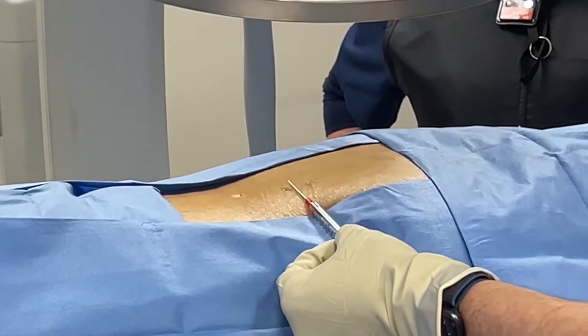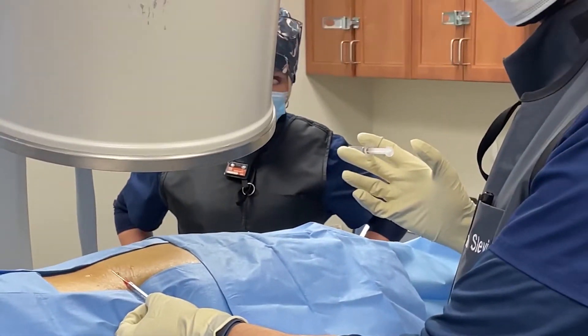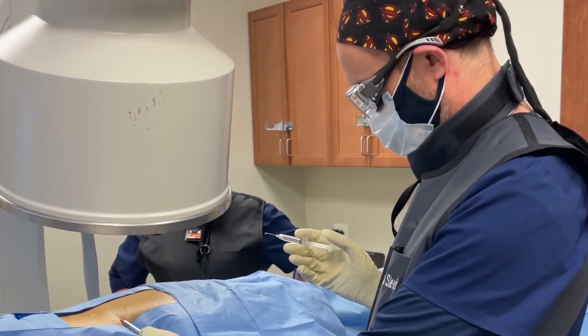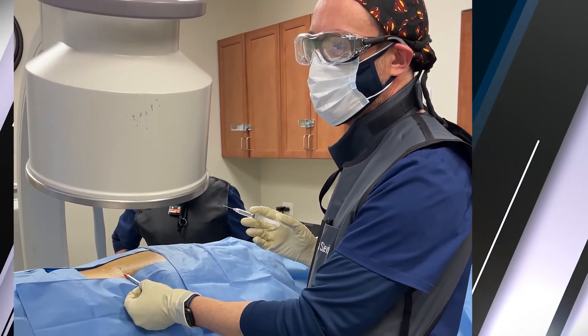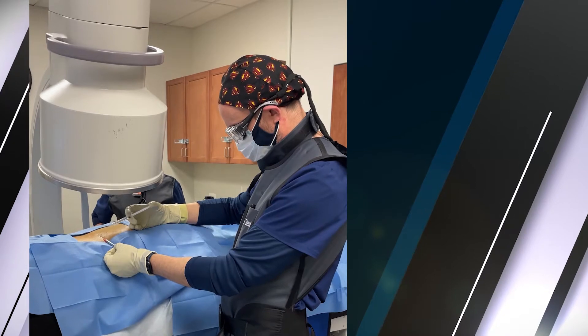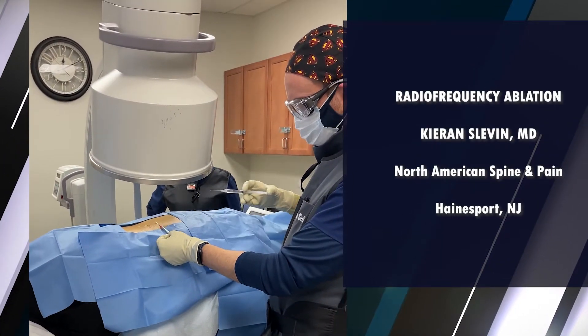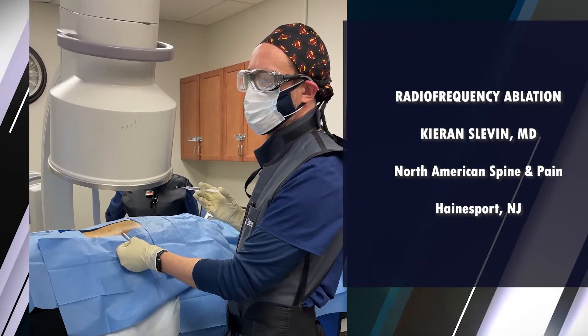The next order of business is to align the C-arm to get the best possible view. As always, you want to get the right view whenever you're doing an interventional spinal procedure. Spend an extra couple of minutes taking the time to get that view correct before you start the procedure — it is time well spent.